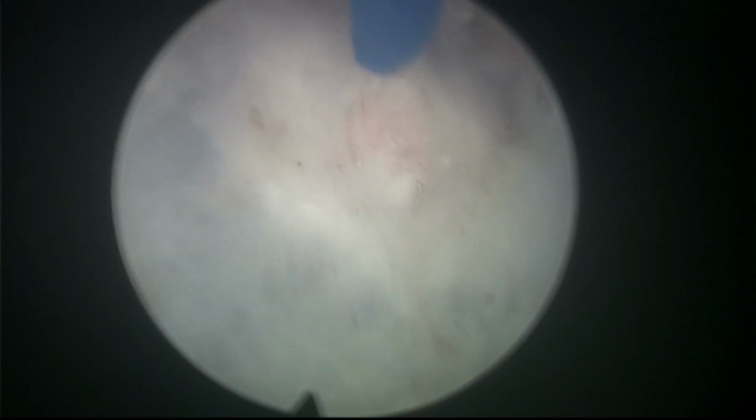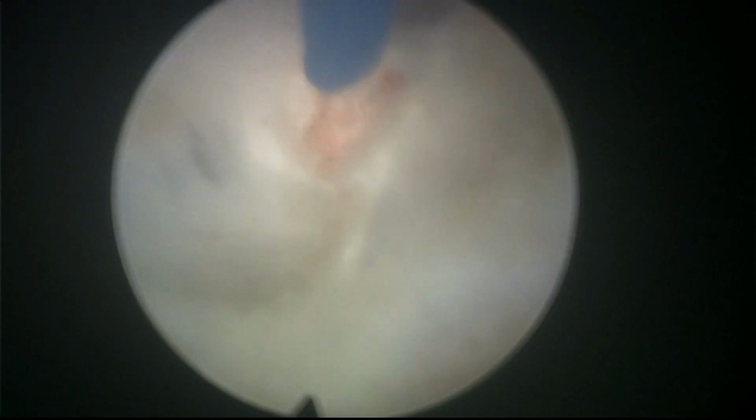But again, the circumferential nature of this incision, of this dissection line, is helping a lot, because you can see that it makes sense to go around like that and to follow the line. You can anticipate a little bit how the anatomy is going to be. Irrigation is excellent, visibility is excellent. The hemostasis provided by these lasers makes the procedure more comfortable.